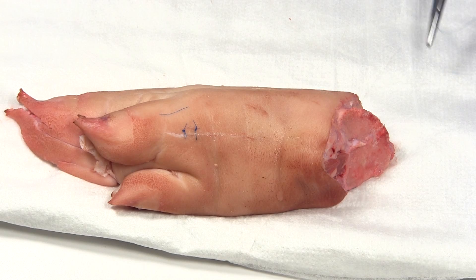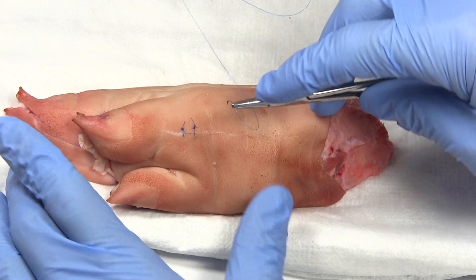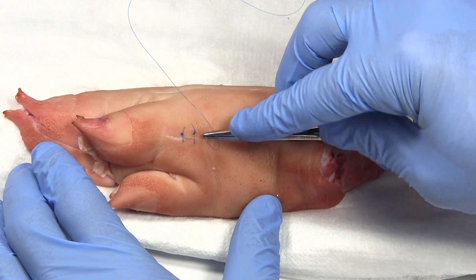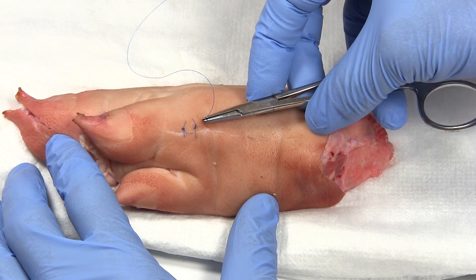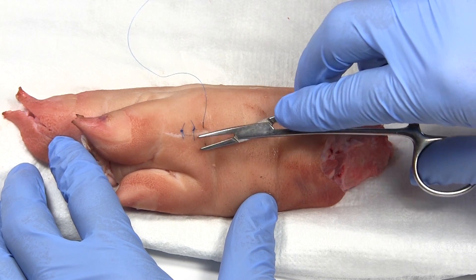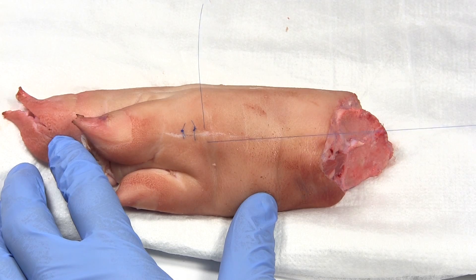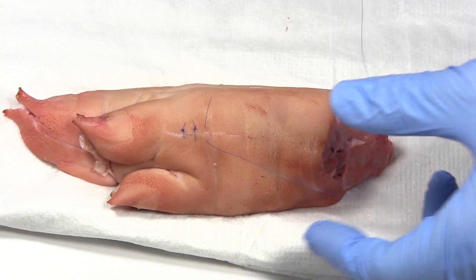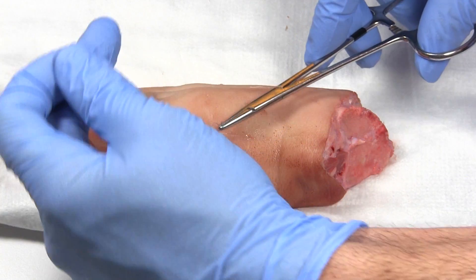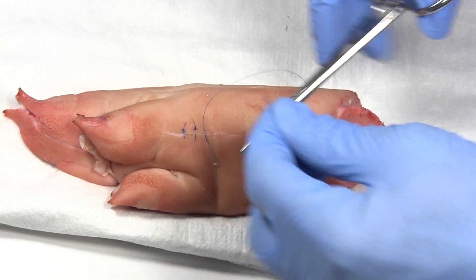When do you want to use a simple interrupted suture versus a running or mattress suture? If you're just putting in a few sutures — two or three — this is probably the way to go. It's quick and easy. Another good time is if you have a wound that might get infected. With an infected wound you may need to take one stitch out to let drainage out, and you can't do that with a running suture. Also, when you're just starting out, these are a lot easier to do.